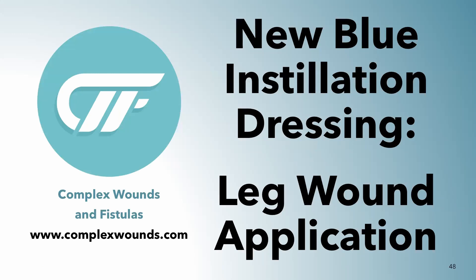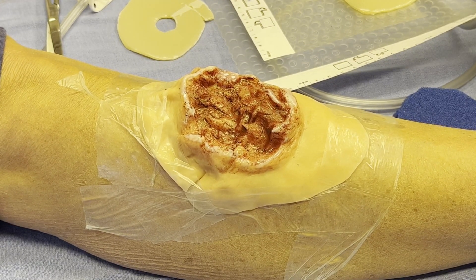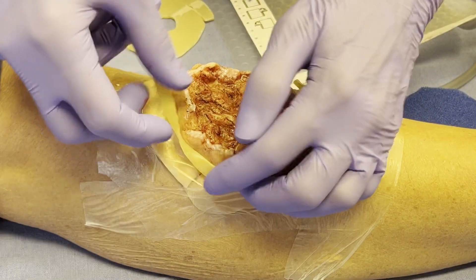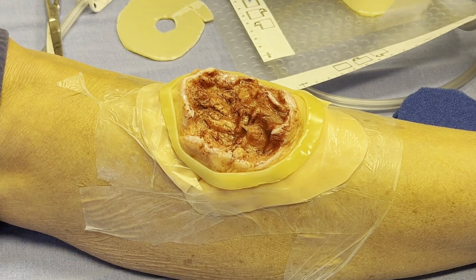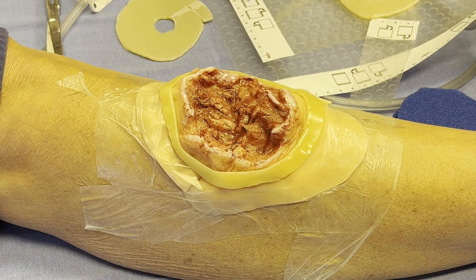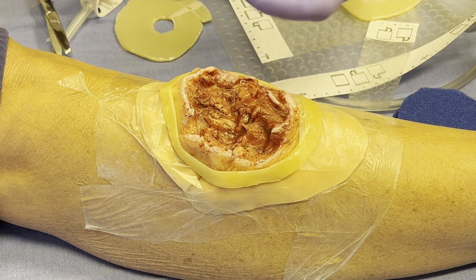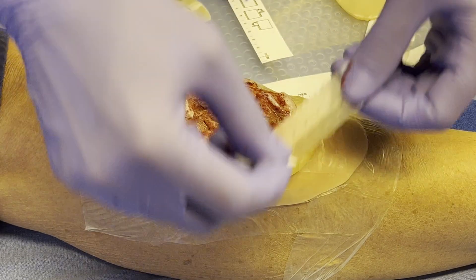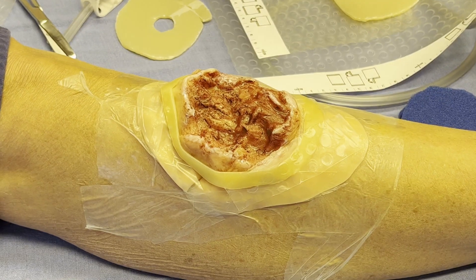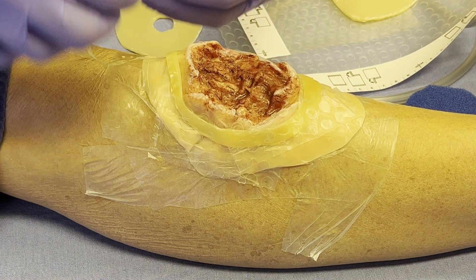Now we're going to do an actual demonstration on Barb's leg. This is a leg wound, and we're going to demonstrate placing Cleanse Choice Complete Dressing with a medium foam that has the trackpad and the instillation combined. We're going to put a barrier ring around the edge because we find that helps a lot. I'm going to use little strips to picture-frame on top of my barrier ring, just like this. I like to hang those strips right into the wound edge so that you have less pain when you take off the drape. It helps you get that seal because you set that barrier ring back half a centimeter. This junction here really helps you get a nice tight seal so the dressing won't leak during the instillation phase — because during instillation there's no negative pressure deployed, and that puts your dressing at risk of coming loose.